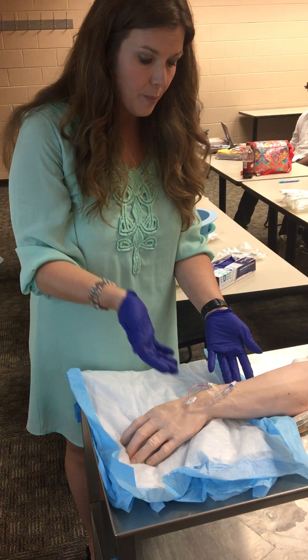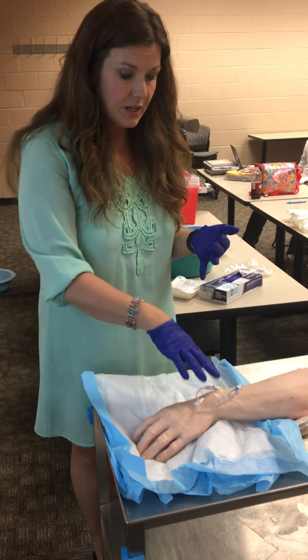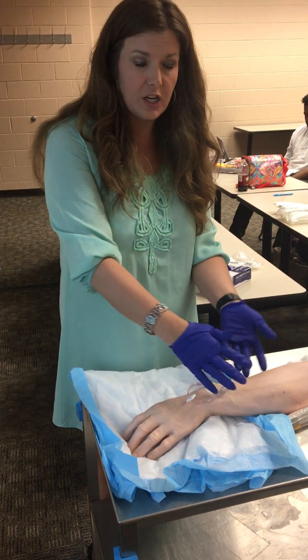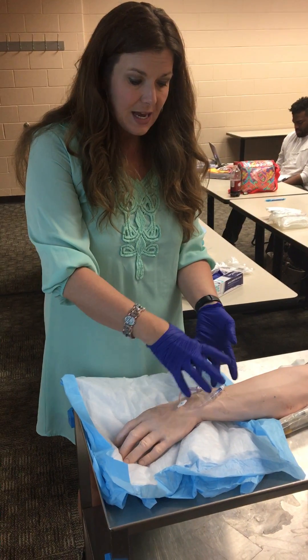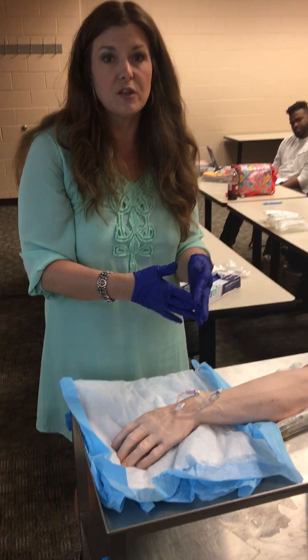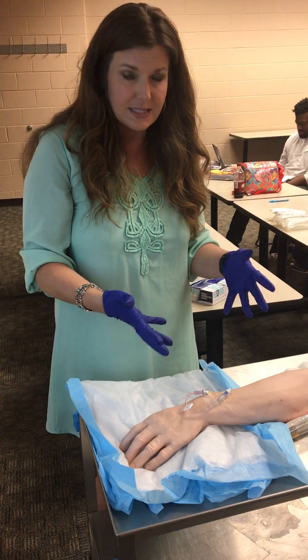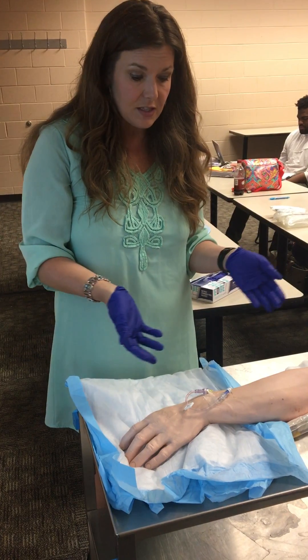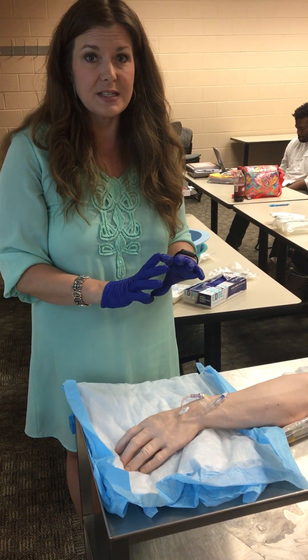The next part is checking for complications. You're going to be looking for redness — is there any drainage, infiltration, or extravasation? Is the vein red? Are there signs the fluid is not going where it should be? You're looking for all of that to make sure everything looks the way it should. Then the last piece is that you would document your findings. That's the assessment part.